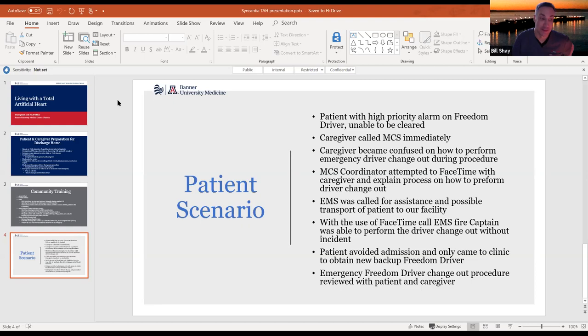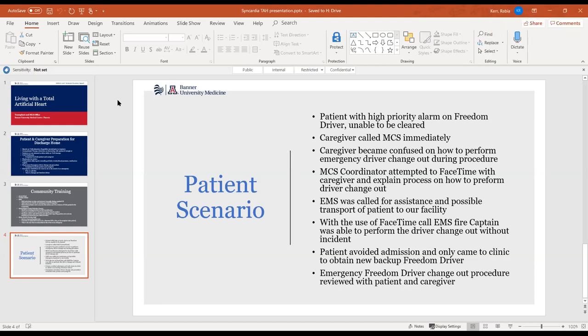I just have a question. Have you guys experienced any fracture drivelines? We have had the springs fall, tip up sideways. We had to change out our CPC connectors. But other than that, no fracture driveline. Oh, and we used the rescue tape as well on our drivelines.